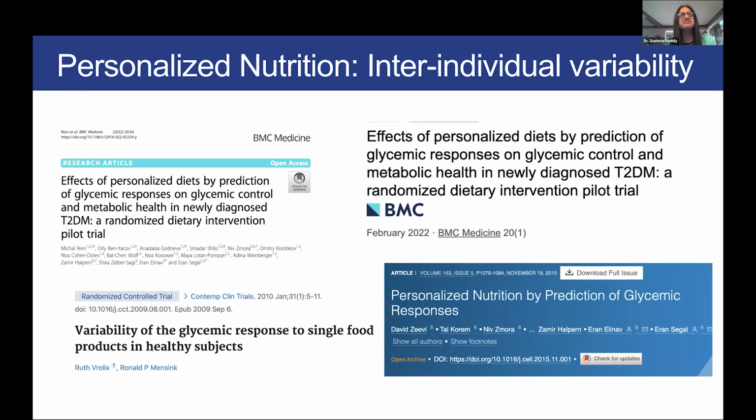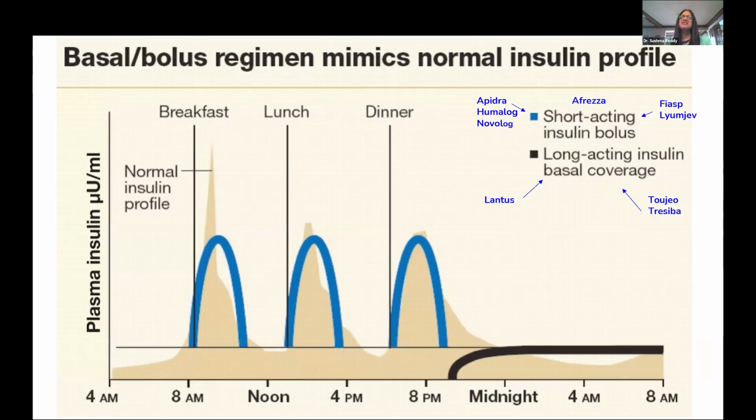And in your patients on insulin now, you can also calculate the dose of insulin, or they can see, when I eat cereal, I tend to go up higher. Do you think I should add an extra unit? They'll be coming back to you and asking you those questions. And then patients need to understand, if they're in a basal bolus regimen, how it works. And by putting the CGM on them, they start to understand. And I know all of you are familiar with this.